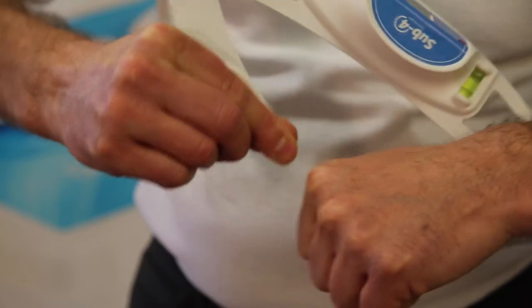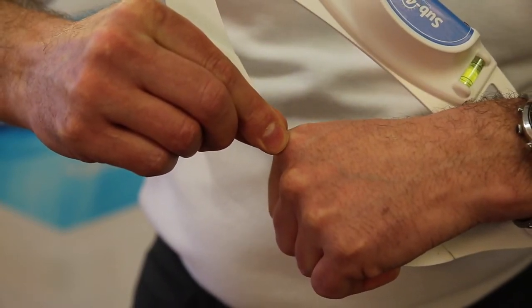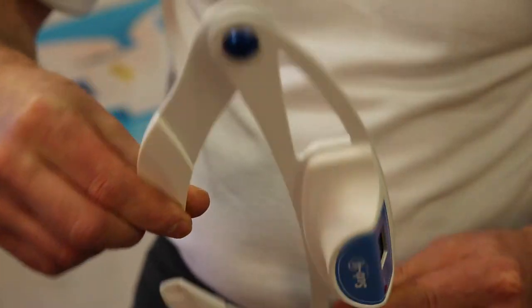The DPI can measure all kinds of widths of the pelvis, and it's actually your fingers that touch the bony prominences on the pelvis before taking a reading.